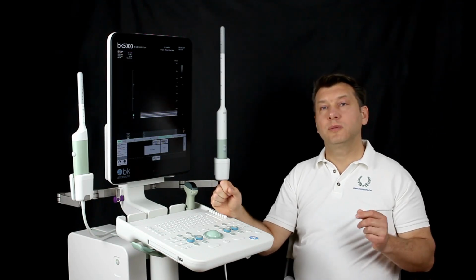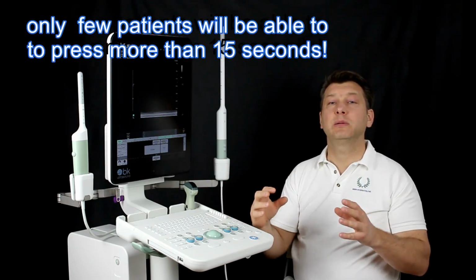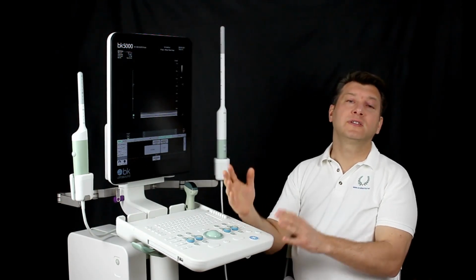However, if we want to observe the changes in the Valsalva maneuver, we do need to reduce the time, because only a few patients will be able to press for more than 15 seconds. However, this also causes the distances to rise.